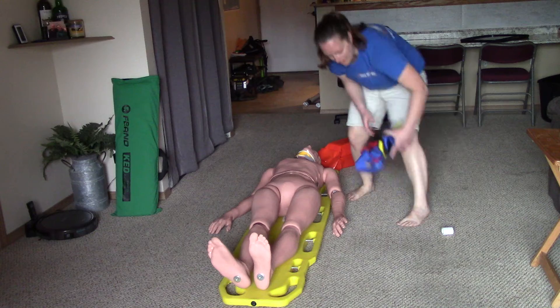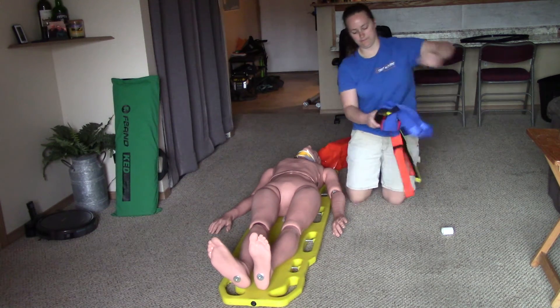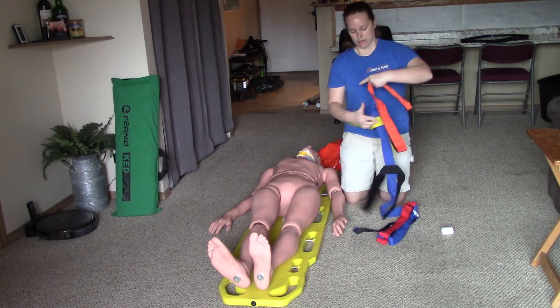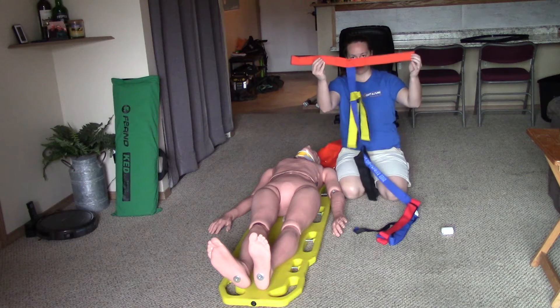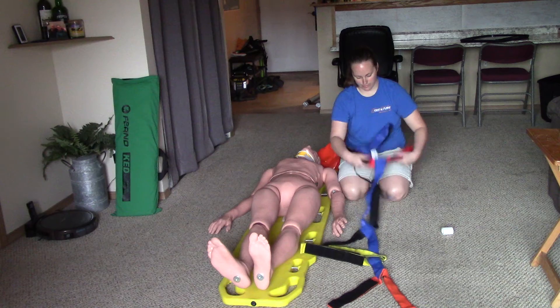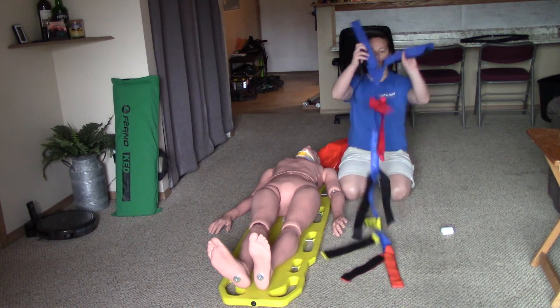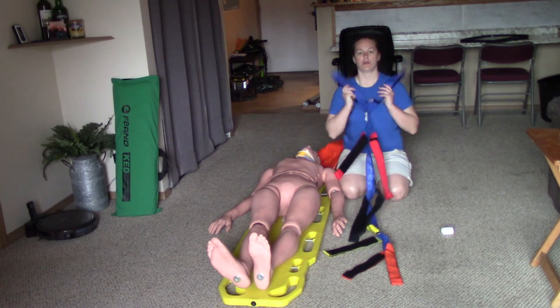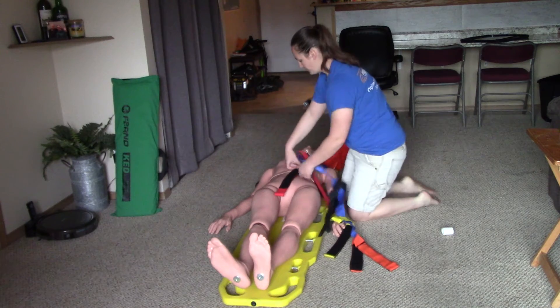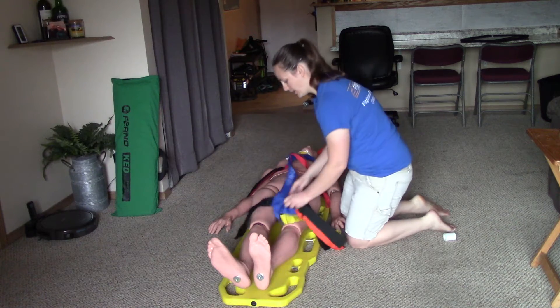I'm now ready to start securing my patient to the backboard. I'll use spider straps this time. At the bottom of the spider straps it goes straight across the lower legs. At the top, the straps make a Y shape that goes over the shoulders. I'm going to lay this Y over the shoulders and take the blue piece through the middle, getting it straight all the way down the middle of the body.